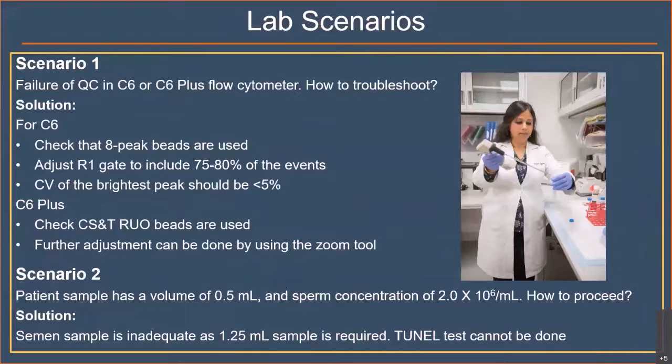When we perform the sperm DNA fragmentation using flow cytometry, there are many situations which can occur, and each of these situations I have illustrated as scenarios and also identified how we troubleshoot in each case.